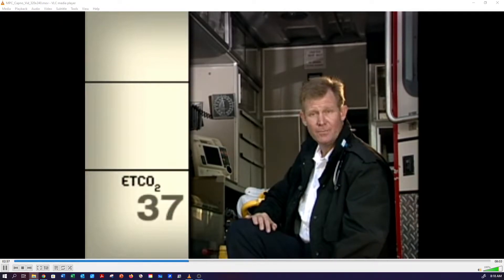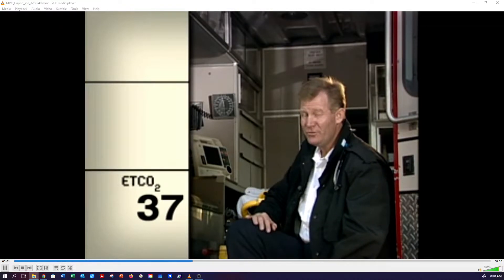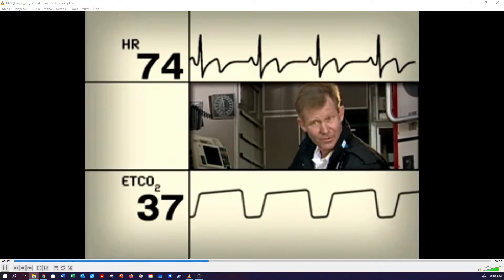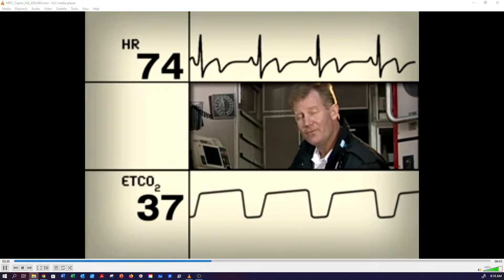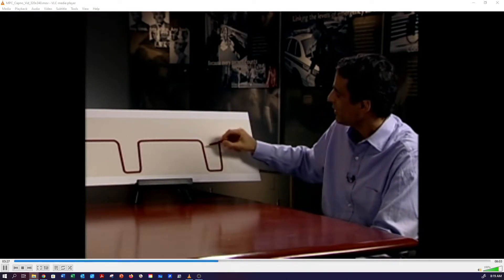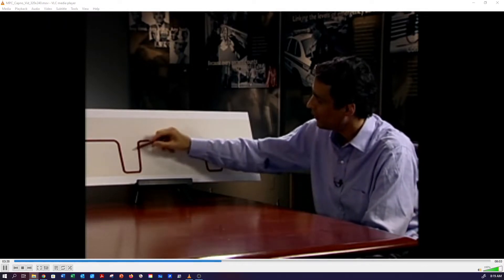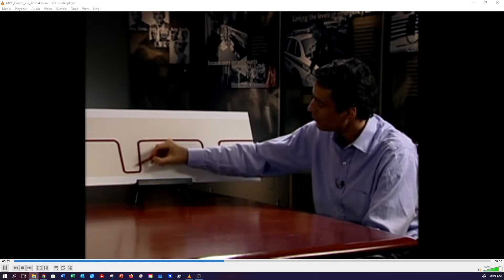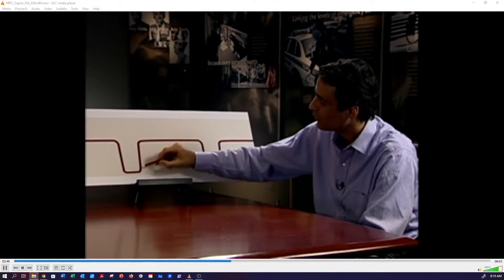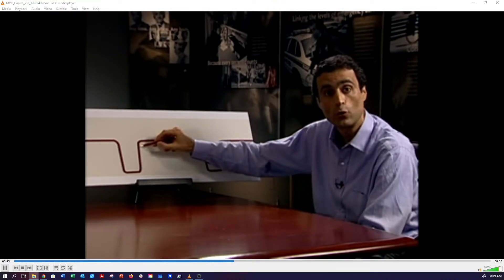End-tidal CO2 is a number — the maximum amount of CO2 during exhalation. That's useful information, but it's not the whole story. It's kind of like how knowing the heart rate tells you something about cardiac status, but to get more detail, you have to look at the ECG waveform. For more detail on a patient's respiratory status, you have to look at the capnography waveform. Think about reading a capnography waveform the same way you read an ECG. Here is a normal CO2 waveform with its characteristic box-like or rectangular appearance.